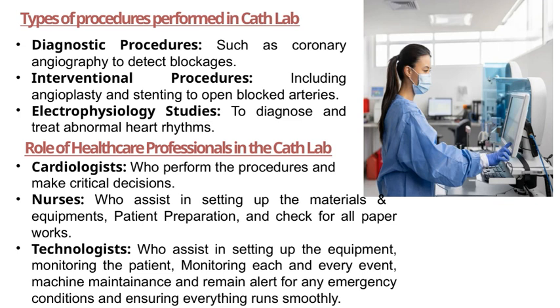We also have electrophysiology studies, which are crucial for diagnosing and treating abnormal heart rhythms or arrhythmias. These procedures help us pinpoint the source of irregular heartbeats and guide us in applying appropriate treatments.